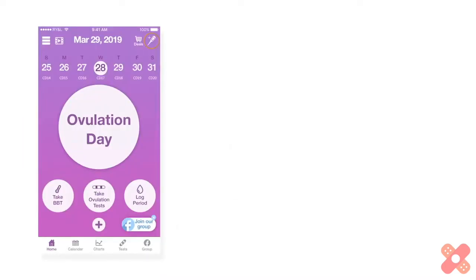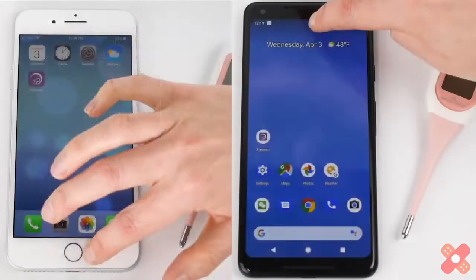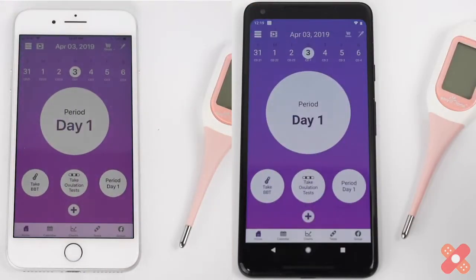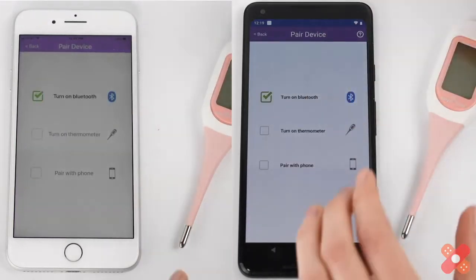Pairing is as easy as one, two, three. Take a few seconds to pair your device. Make sure your Bluetooth is turned on. Open the Premom app. From the Premom home screen, tap the thermometer icon. Select pair immediately.